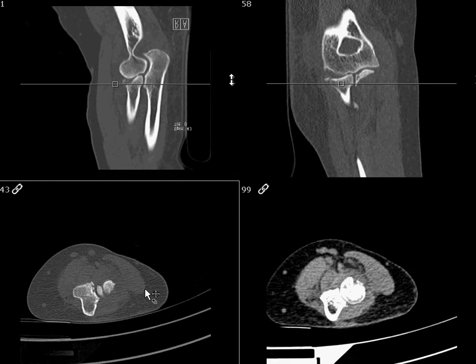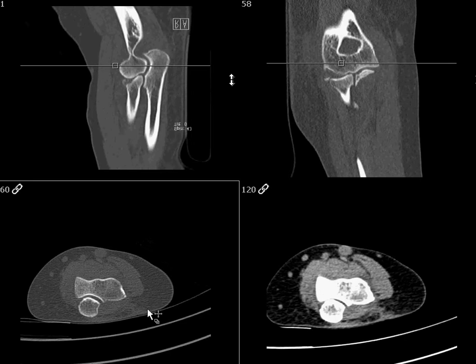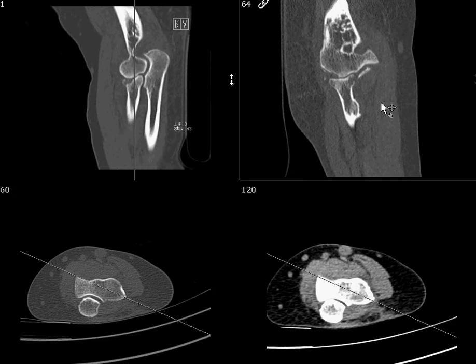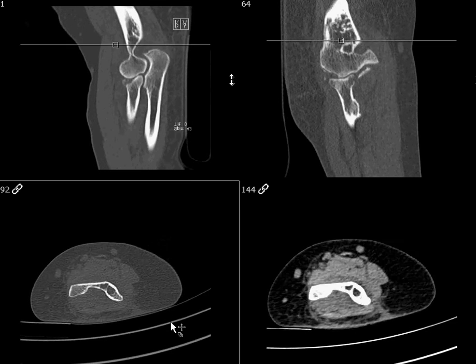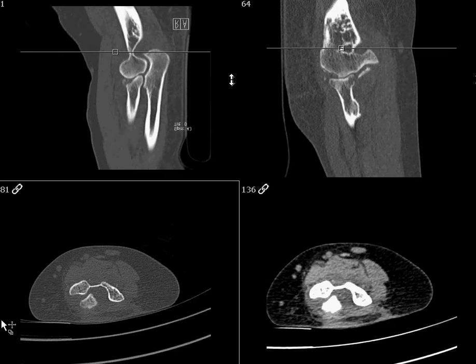So when you make these things, what you really want to use are the epicondyles of the humerus — the medial epicondyle and the lateral epicondyle. In this case, this is the medial and this is the lateral epicondyle. Those are good frames of reference to make coronal and sagittal images, because like all MSK exams, we really want to make images orthogonal to the joint and not necessarily to the tabletop.